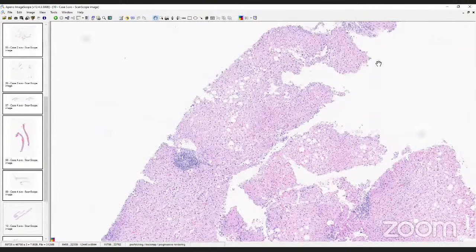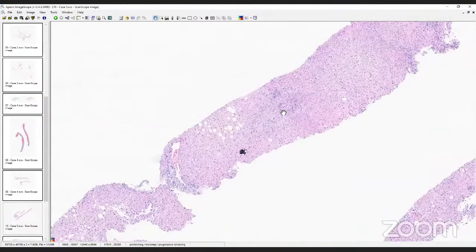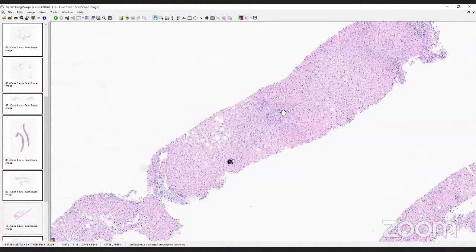And the diagnosis for something like this, where you have lymphocytic cholangitis, it is patchy. So not all portal tracts show that. It's very patchy. The remaining portal tracts show bile duct damage, but there is no interface hepatitis and there's some ductular reaction. The first thought that comes to my mind is primary biliary cholangitis.